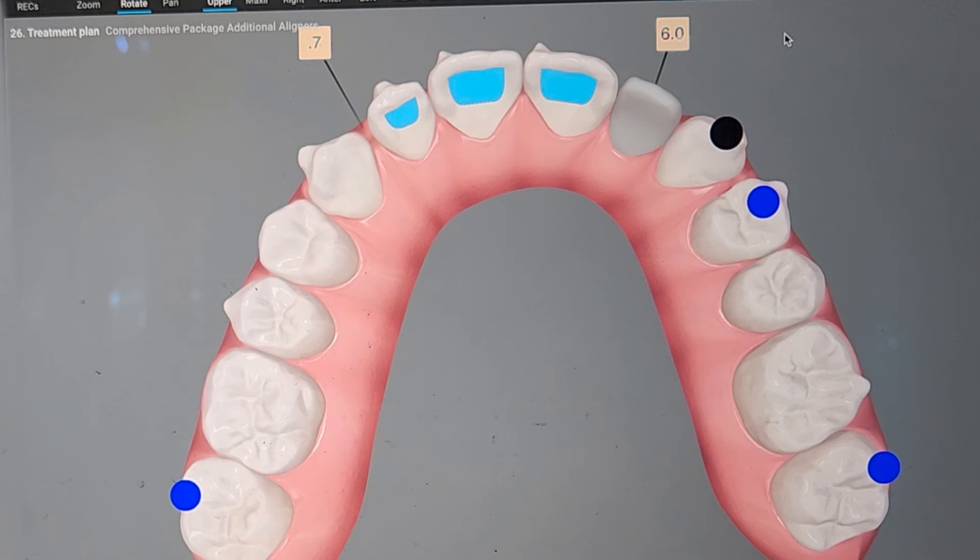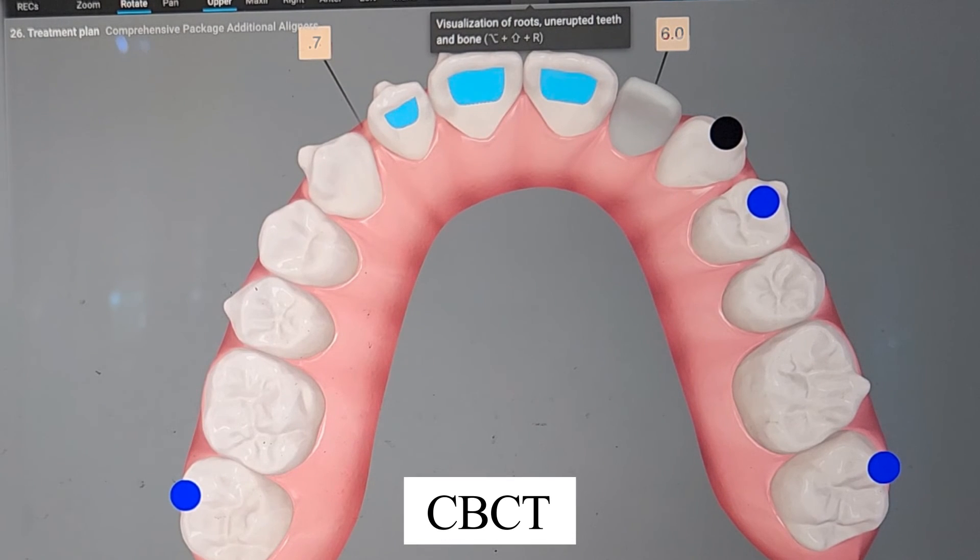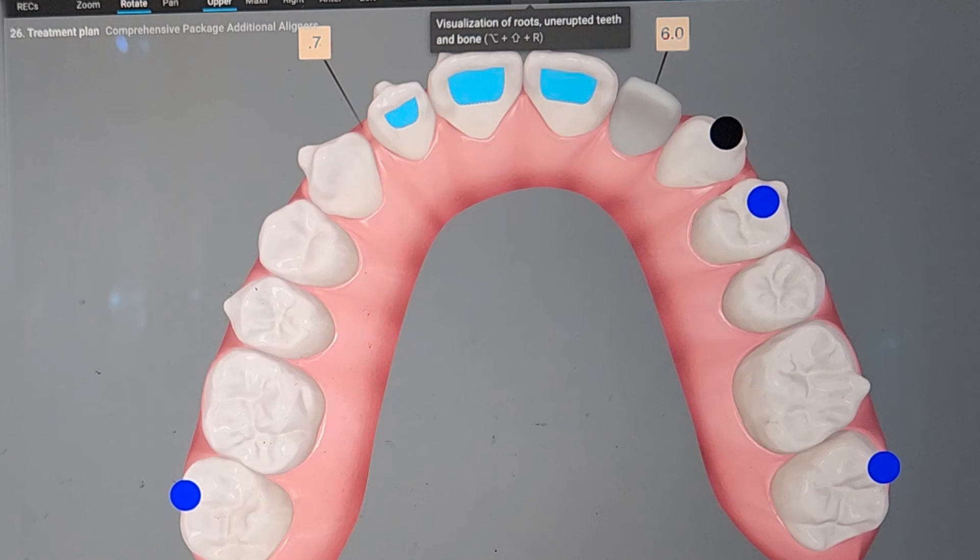The Roots feature is also one of the main things I like to use. If you are using a CBCT and uploading that, it is so powerful — definitely want to be doing this. If you have a CBCT, 100% get it set up. It's going to help you avoid making mistakes, make your ClinCheck more predictable, go quicker. You're going to be less likely to push teeth through the bone, and you'll know if you can expand or procline.